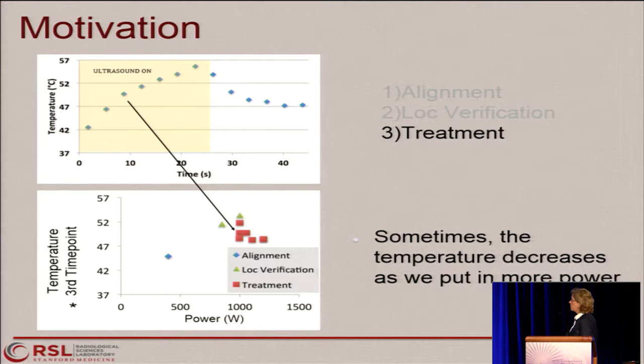We can get up there with a longer duration, but what's interesting is when we take that third time point and plot it down here on our curve, we see that the temperature is increasing through those first two phases, and at some point in some patients there's this inflection point and there's a decrease in the temperature that's been achieved as a function of power.